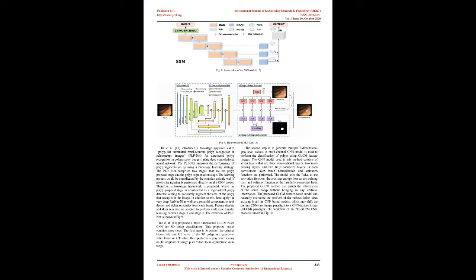Zheng et al. 9 proposed an algorithm for automatic polyp detection and localization in colonoscopy video. An efficient on-the-fly trained CNN has been deployed. To overcome tracking failure caused by motion effects, they also use object detection or segmentation networks such as UNet. It utilizes optical flow to track polyps and fuse temporal information.